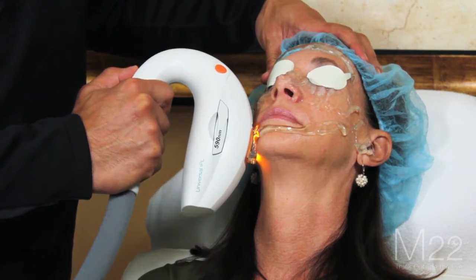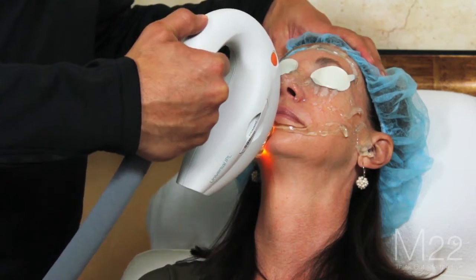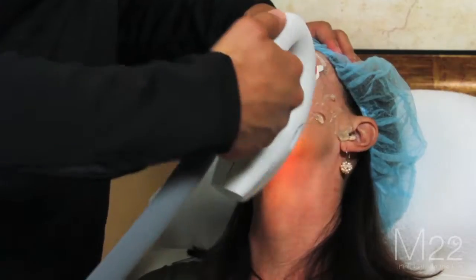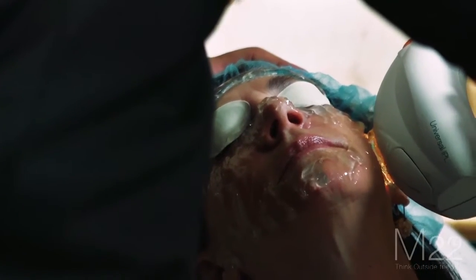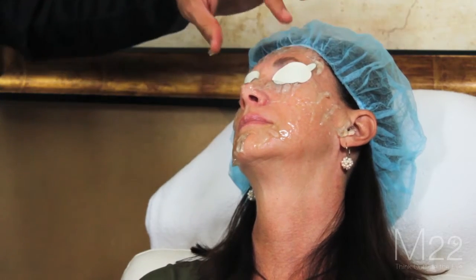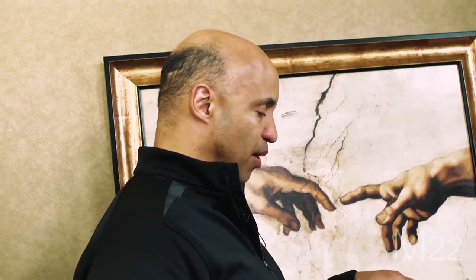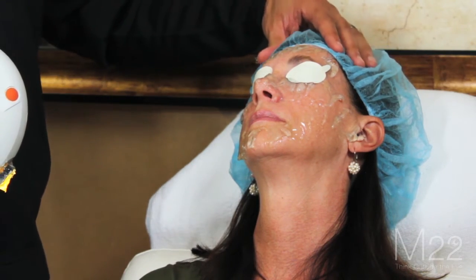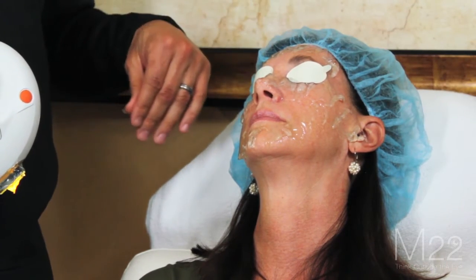Patients are going to ask if you can treat the neck because they're going to like the way their skin looks. You don't want to treat below the jaw line because there are some studies showing that low-level light therapy can stimulate the thyroid. Also be careful not to get near the hair or the eyebrows, since IPL can be used for hair removal. That's why she's wearing a bouffant hair net to keep the hair away.